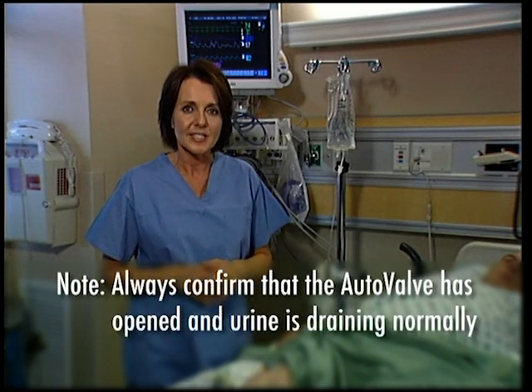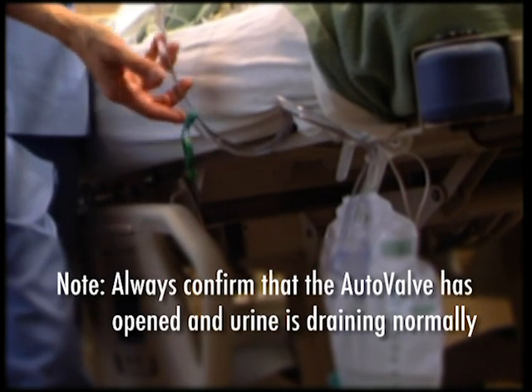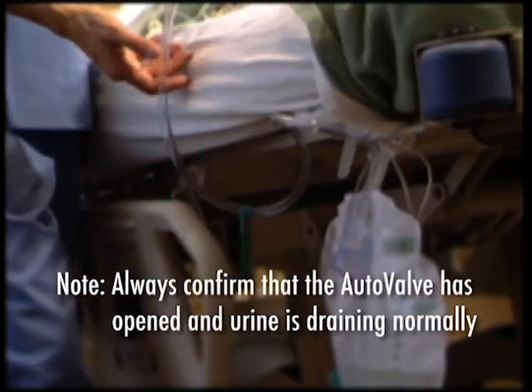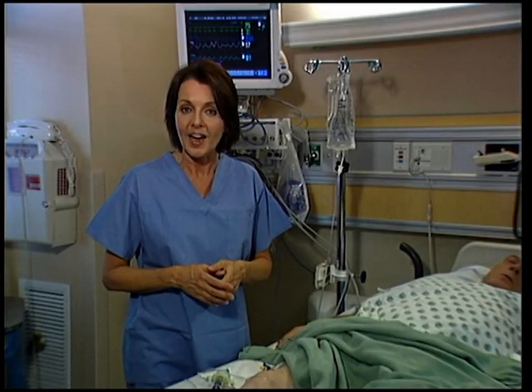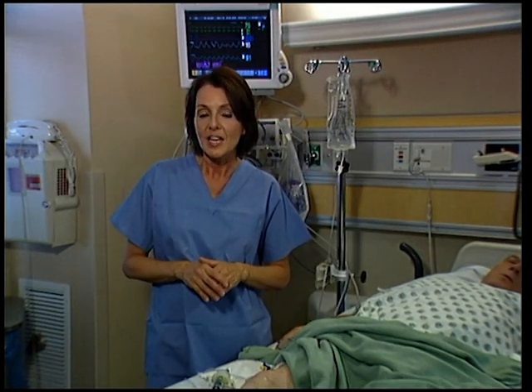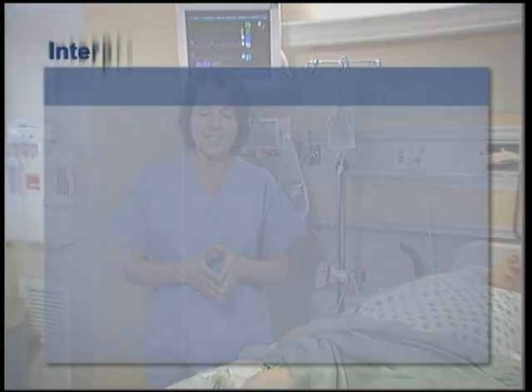Note: if the pressure does not completely decrease to zero, there may be some fluid remaining in the drain tubing. Drain the fluid into the drainage bag and the reading should go to zero, indicating the AbVisor valve has opened into the drain position. Record the infused fluid in the I&Os. Repeat this one-step infusion process every one to two hours for the first 12 hours to establish a trend and detect any significant pressure elevations early in the disease process.